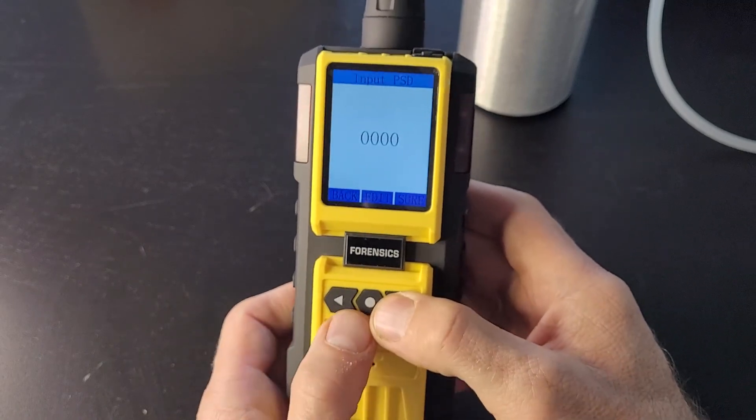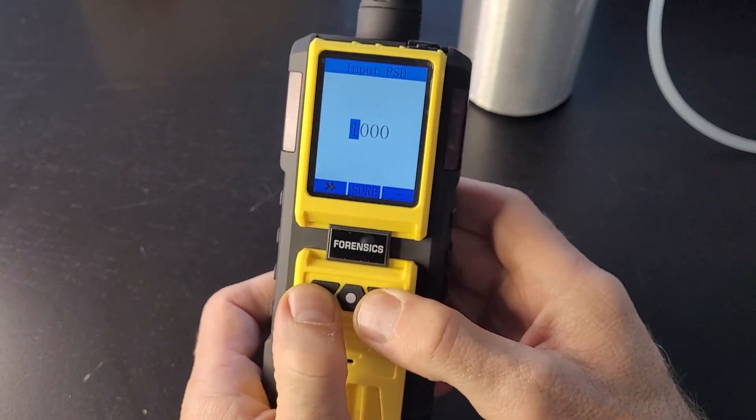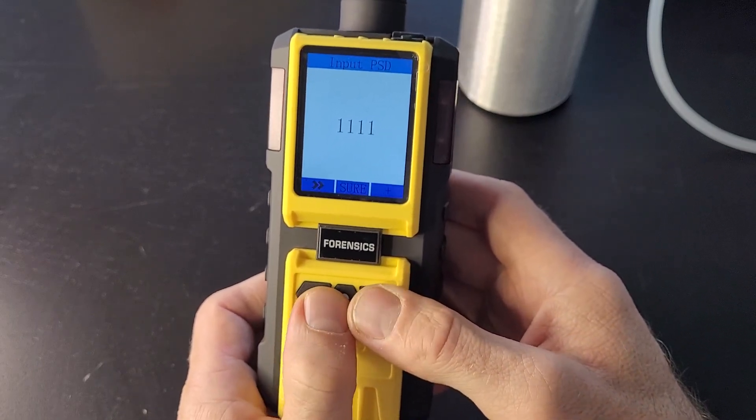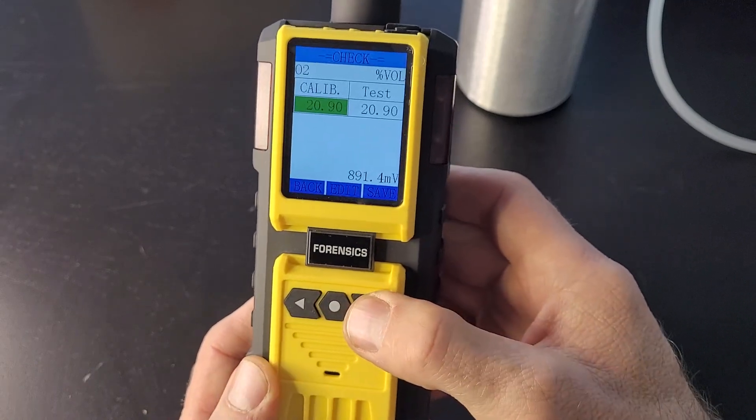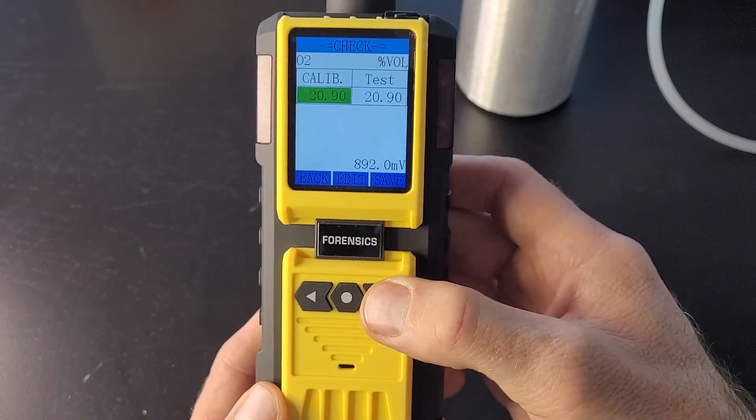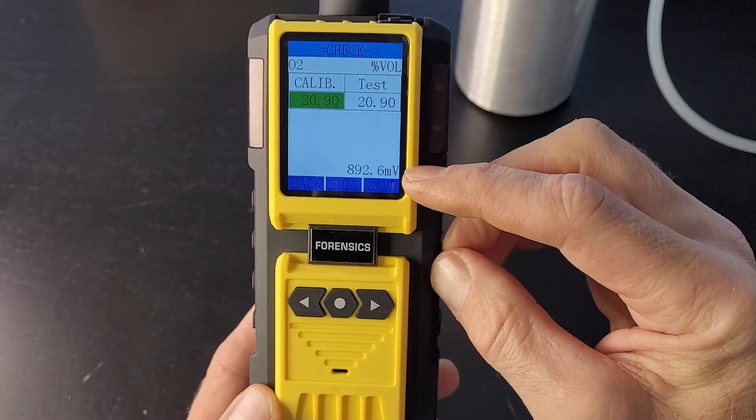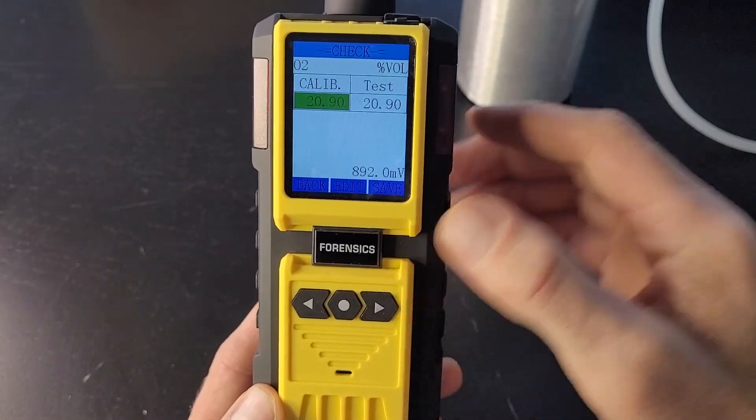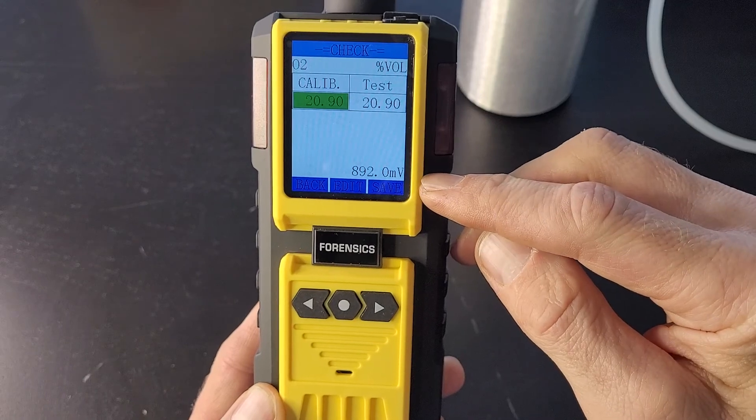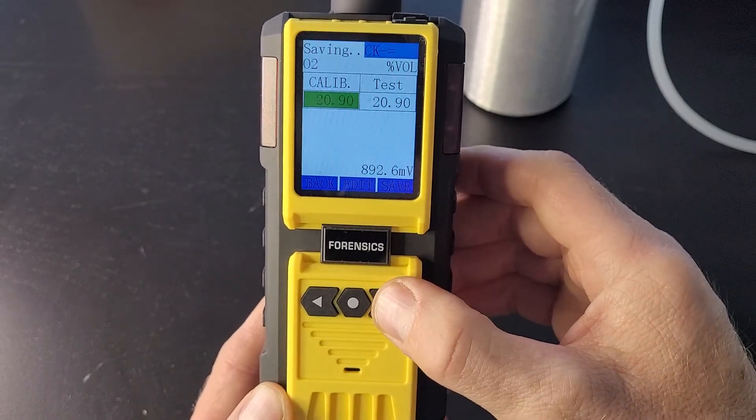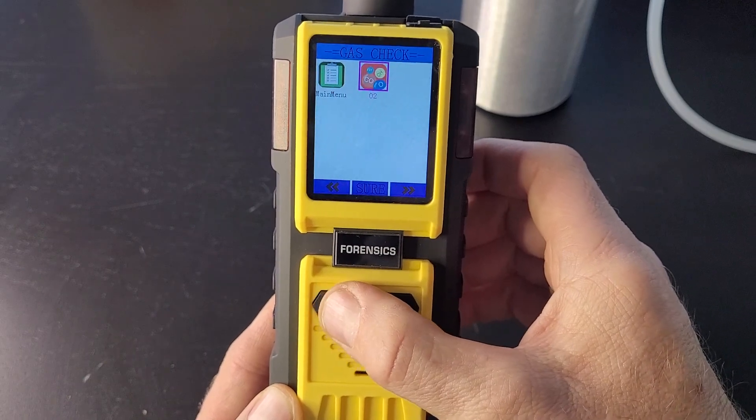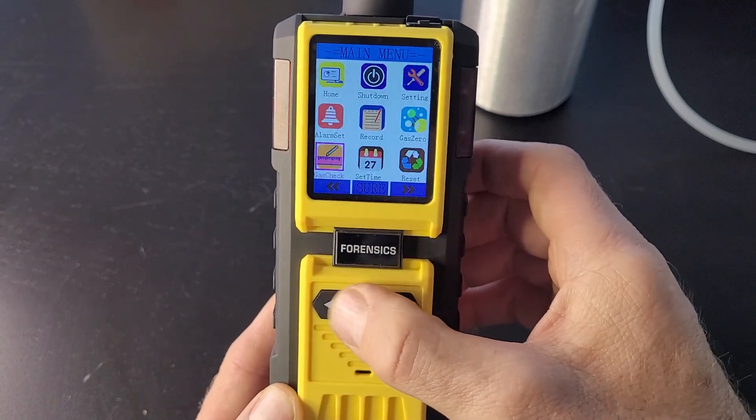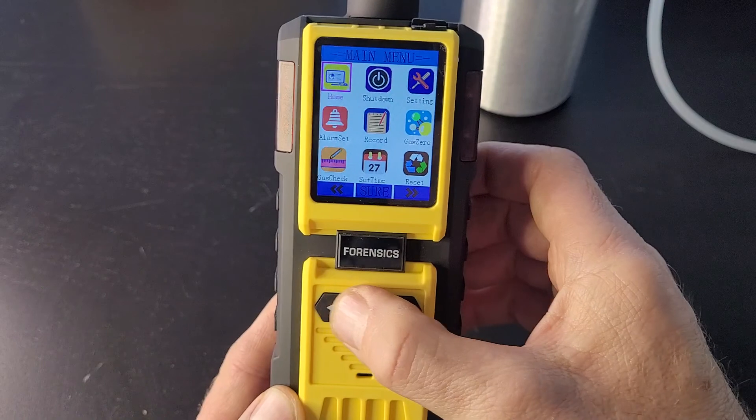The second part is for us to actually undertake the span calibration. Go to gas check. Put in again. 1, 1, 1, 1. Enter. And you want to lock it in to 20.9. You want to do this irrespective because there could be some noise fluctuating in the actual 20.9 voltage level. You want to just lock it in. And then you are done. You have undertaken your 20.9 span calibration.